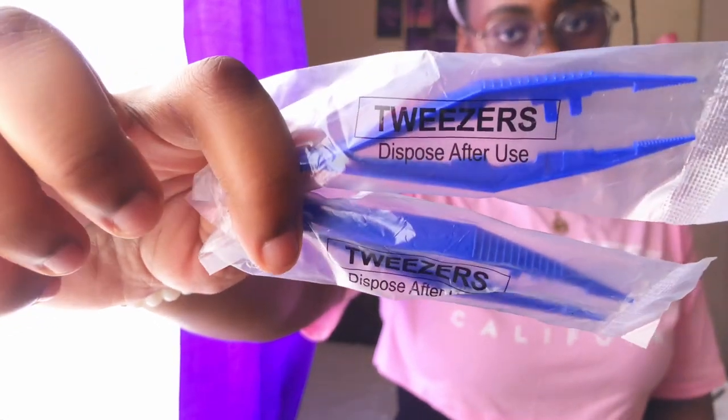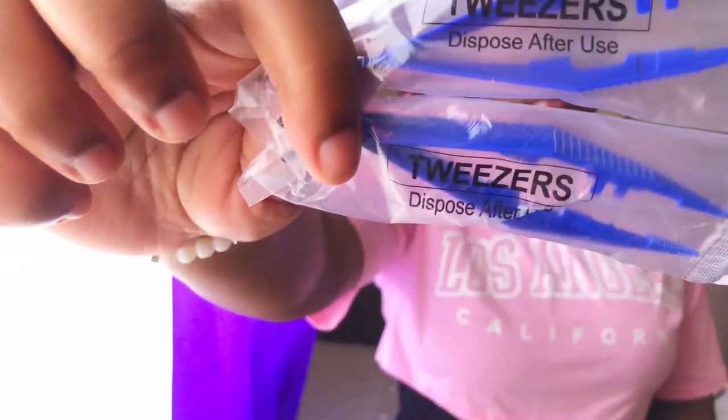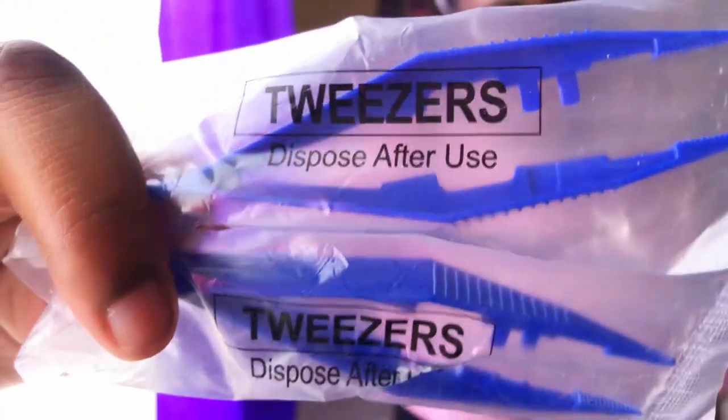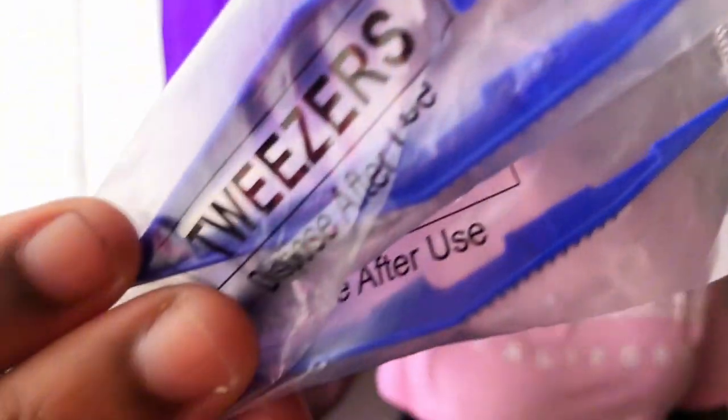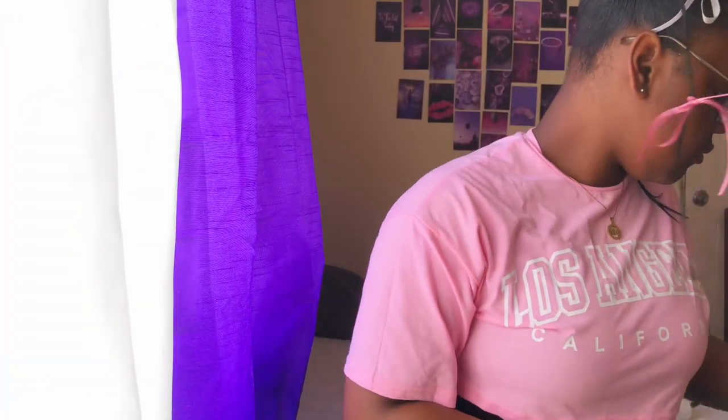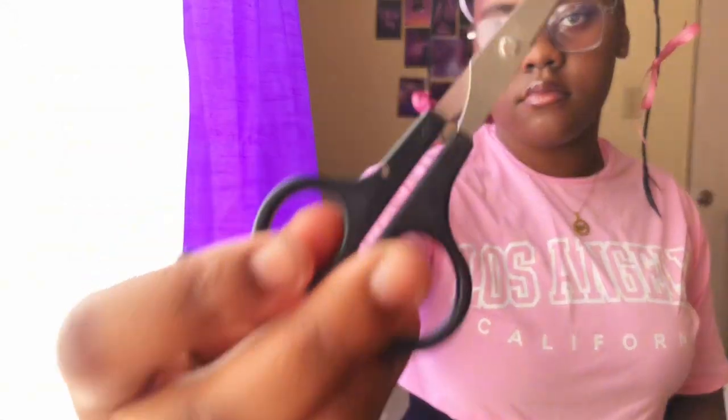The next item is disposable forceps, which are used to remove small objects from a wound. For example, if there's glass in the wound, you can use the forceps — also called tweezers — to remove it. After you finish with them, you discard them.